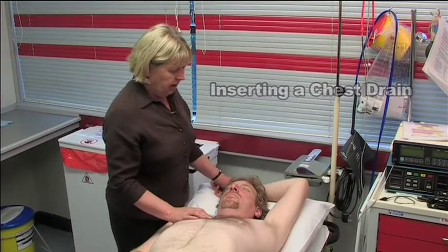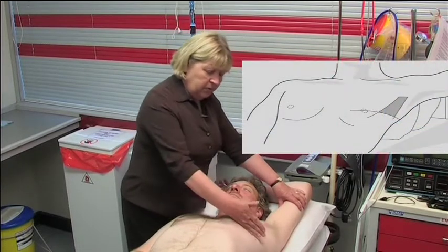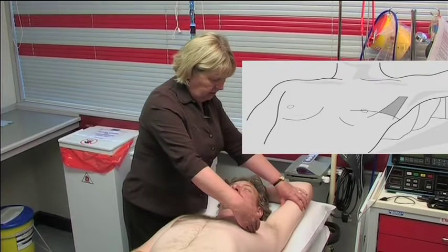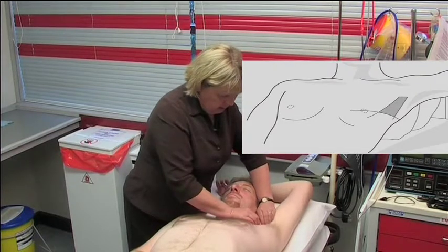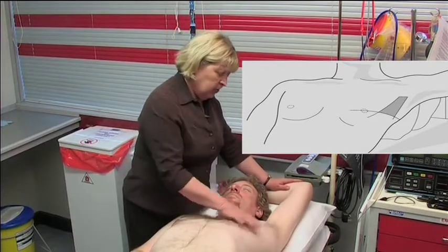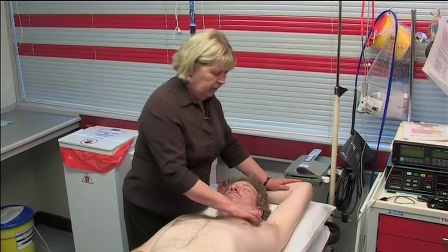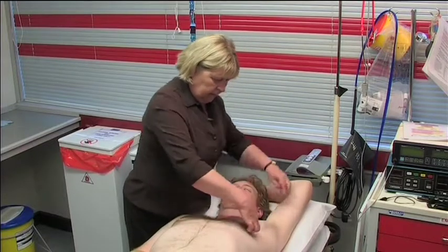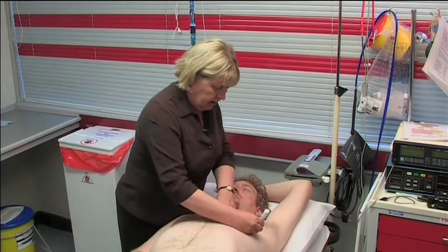There's a triangle of safety within which the chest drain has to be inserted. The triangle is marked at the bottom by a line across the nipple, by a line down the middle of the armpit or axilla, and by a line from the muscle here, which runs down, giving us a triangle. Traditionally, we put it within this triangle in the fifth intercostal space in the mid-axillary line. Counting the ribs down, this is going to be where we insert our chest drain.